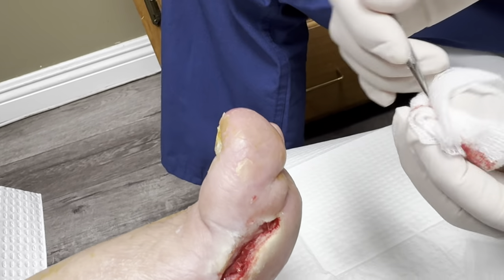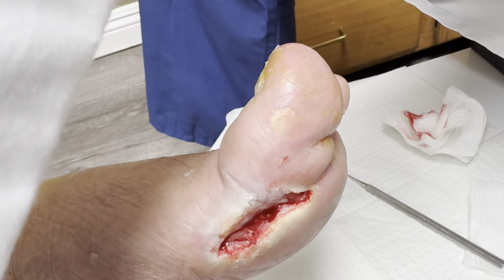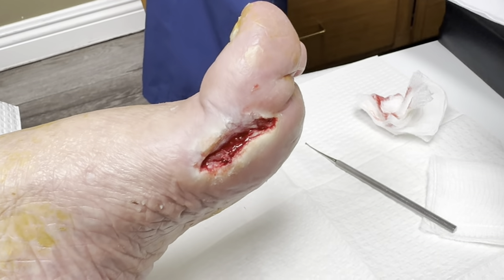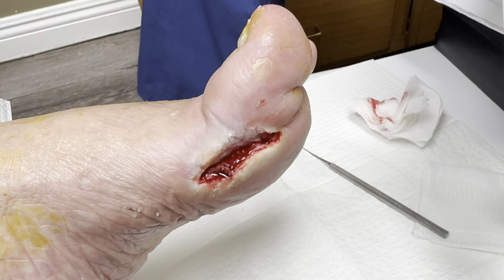Very good — it's bleeding really well. Very happy to see good bleeding. Here's the amniotic graft that we're going to put on, and we're going to anchor it so that it would be nice and tight in there to regenerate all the new tissues.